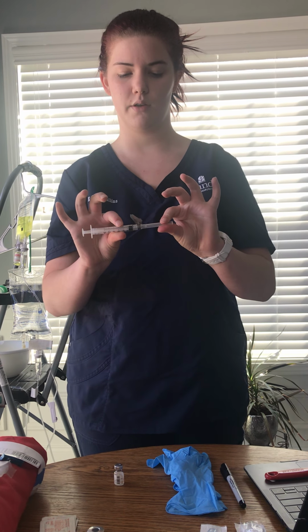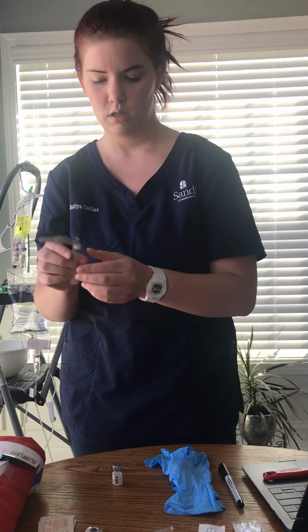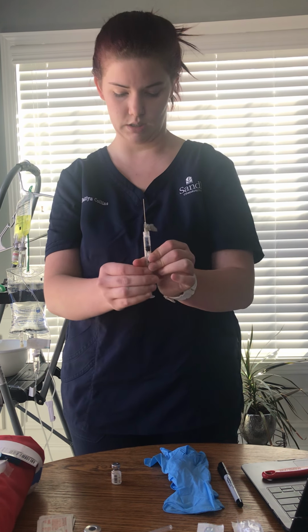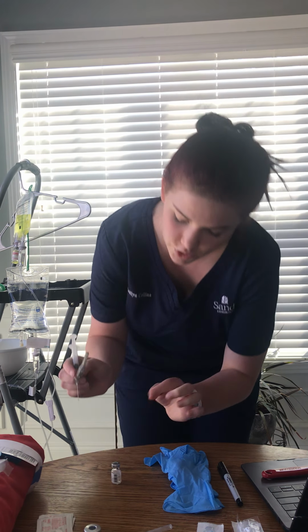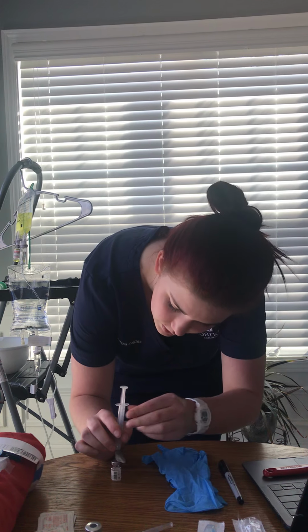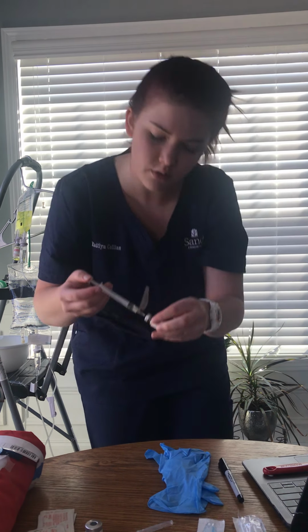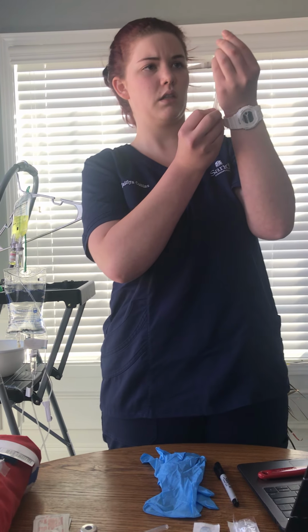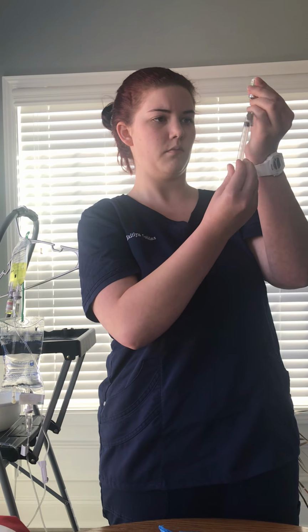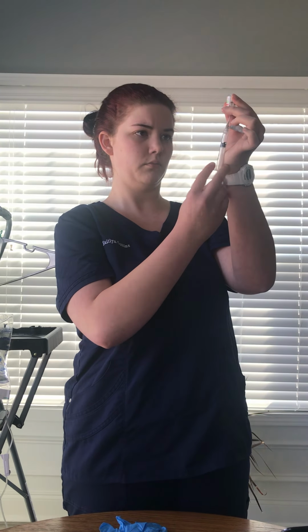Going to pull this off, and 1 milliliter of air is in my syringe, so this is dry, and I will insert this and the 1 milliliter of air, and then I will draw up 1 milliliter of lorazepam. It's quite a bubble.